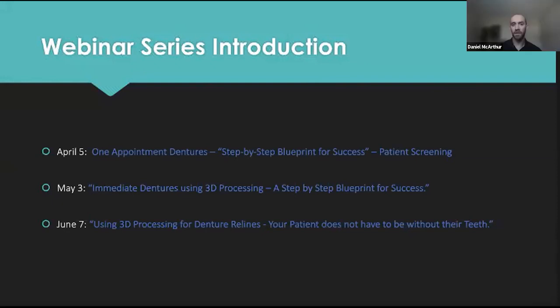We have one from Dr. WMJ. Can I duplicate a tooth-borne cast RPD easily? Would there be any tips? For cast partial dentures, I don't scan the denture like I would with a complete denture. I just scan the patient's mouth. I should have had an example, but I just scan the patient's mouth, not the partial denture. I only scan complete dentures.